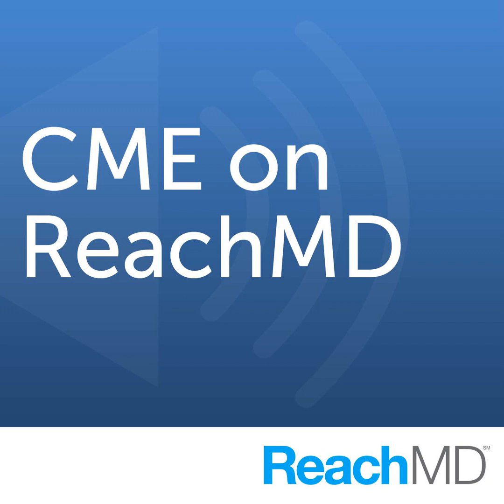My disclosures: nothing relevant to the topic, but I'm in love with CMR. You know, when you think about HCM, in my opinion, it's extremely important that in the last cardiomyopathy guidelines, the phenotyping, and especially CMR-based phenotyping, really got a new level.